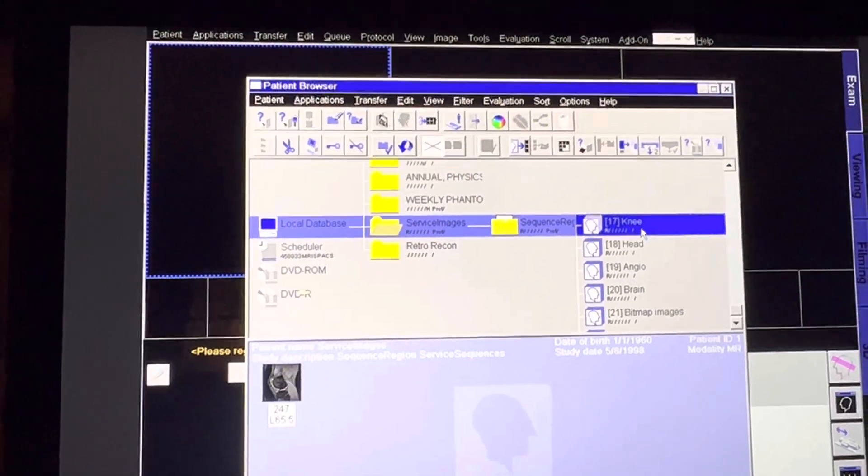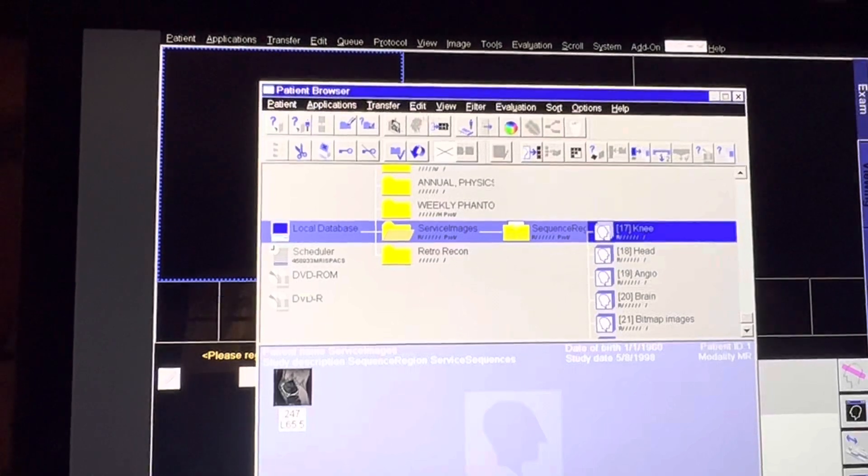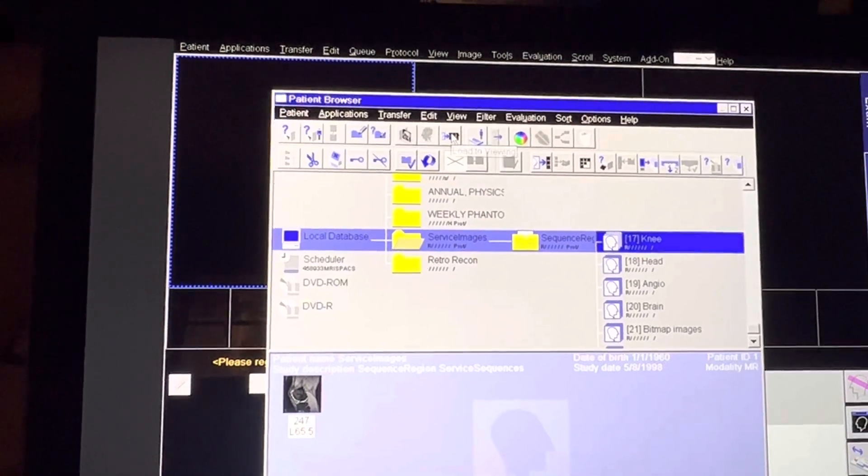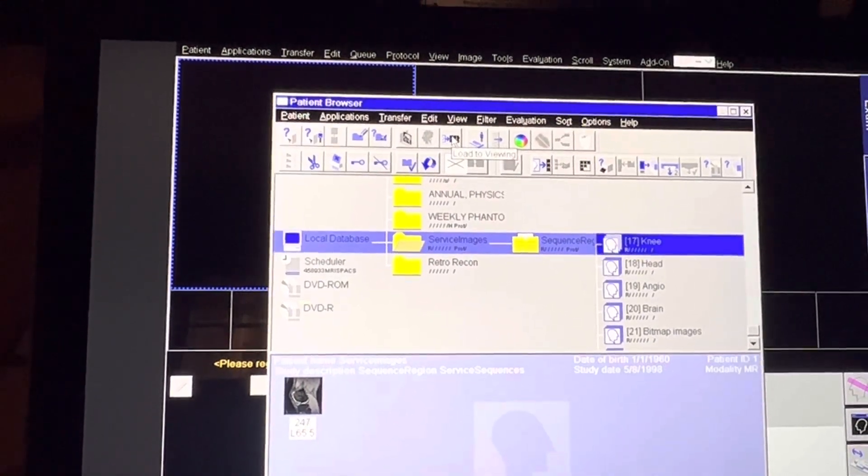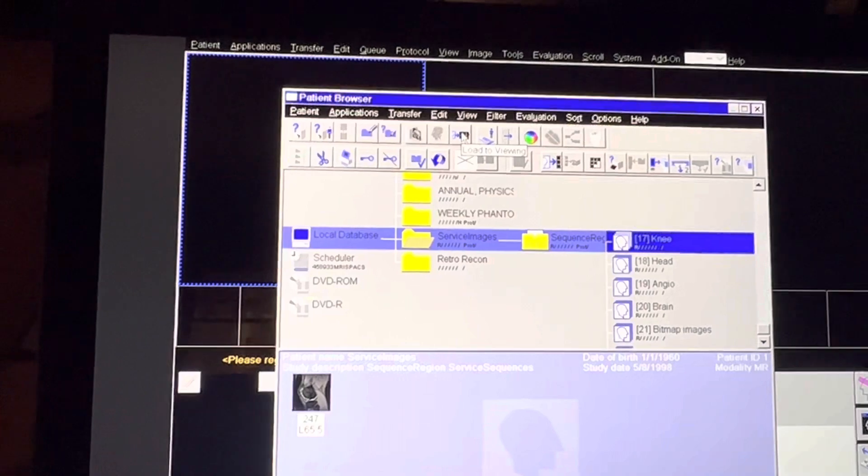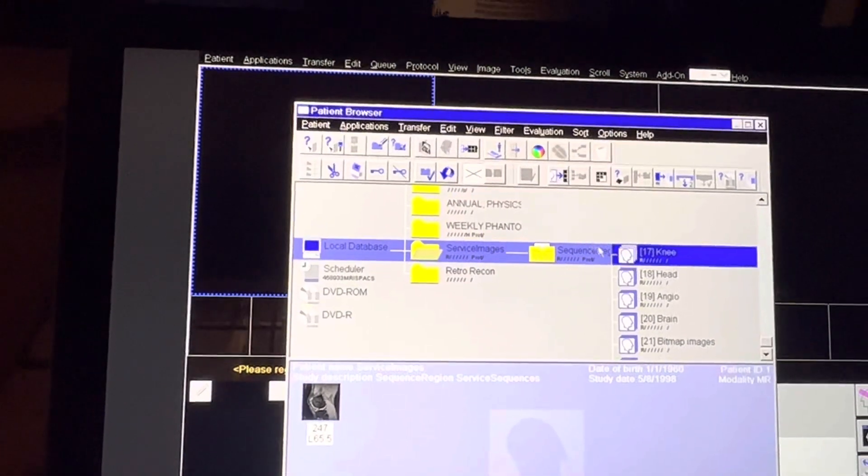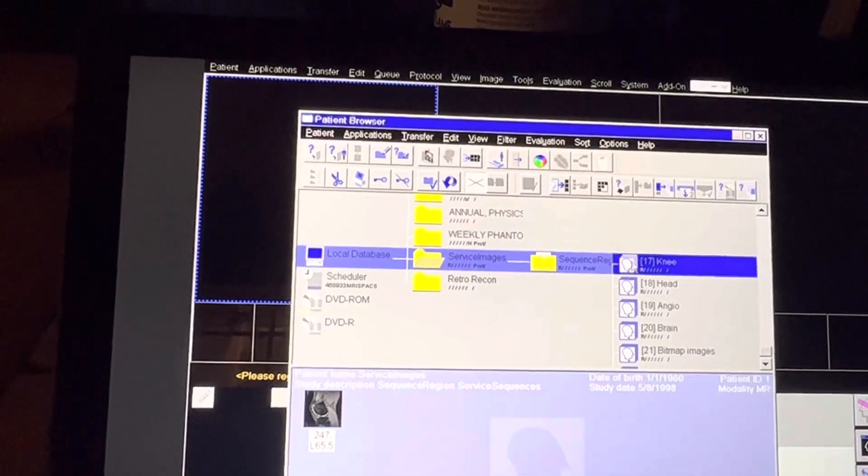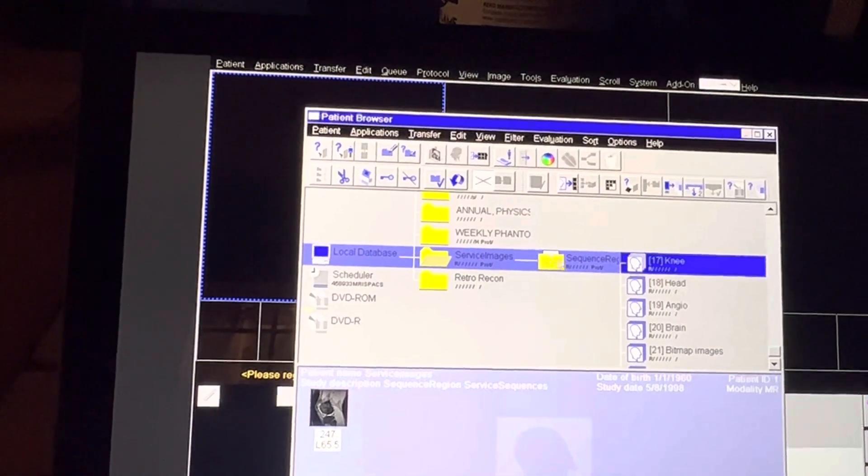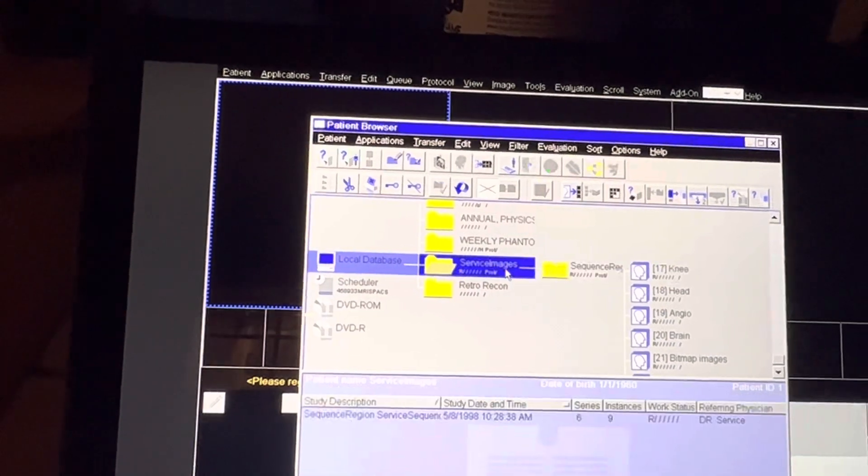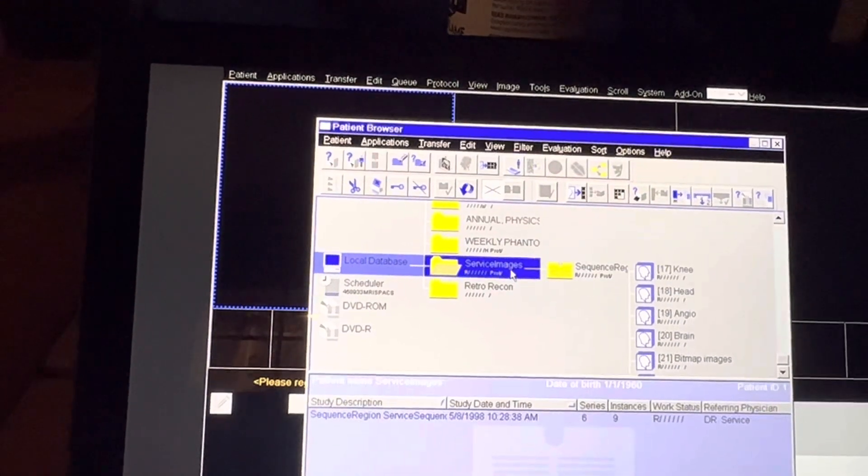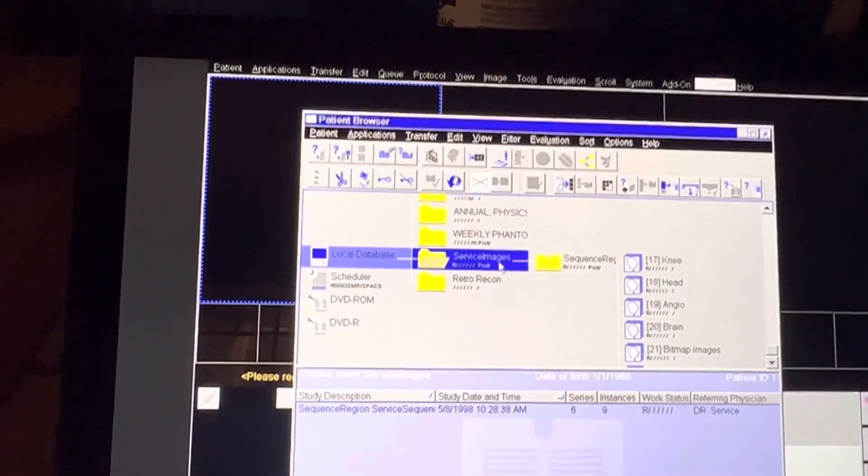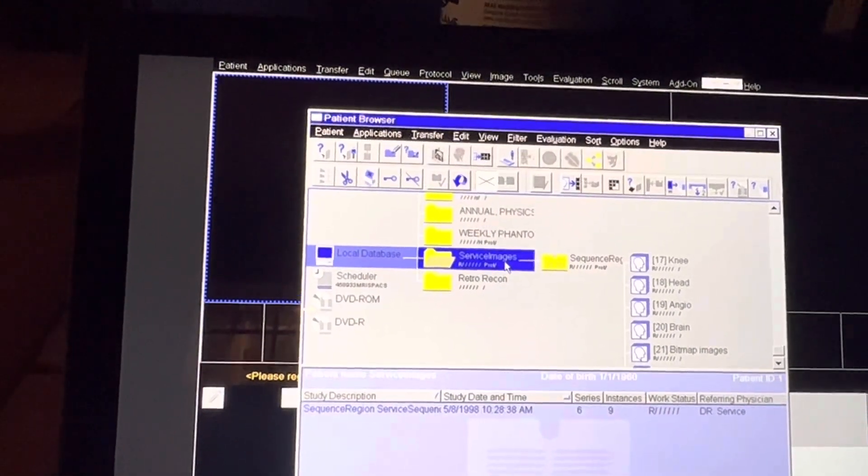Now, if I click on this one image of the knee and I click this tab right here, which if I hover it'll say 'Load to Viewing,' it'll just load this one single image.